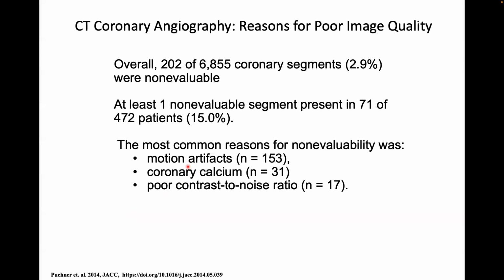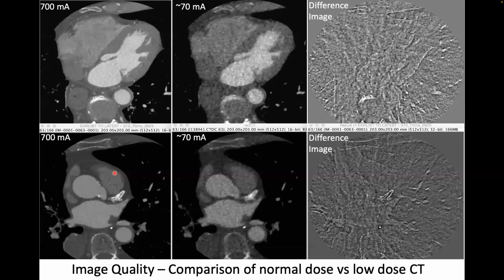But motion artifacts are always going to be a problem because we're always going to be increasing the spatial resolution. So if you double your spatial resolution, your motion artifact control has to be twice as good, right? Because now we're into really small motions causing motion artifacts.